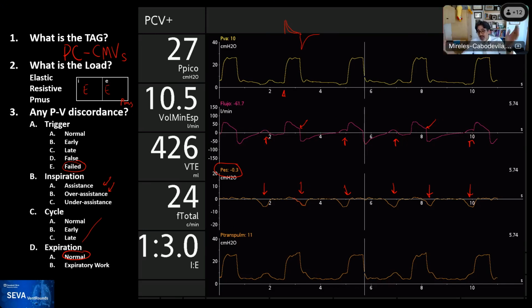And there are studies out there that now demonstrate that the presence of esophageal pressure, either simulated or the true one, helps you read patient-ventilator interactions a little bit better. And so I think that this is an important feature for you. I mean, we rarely put an esophageal balloon to detect synchrony issues. Should we? Perhaps.